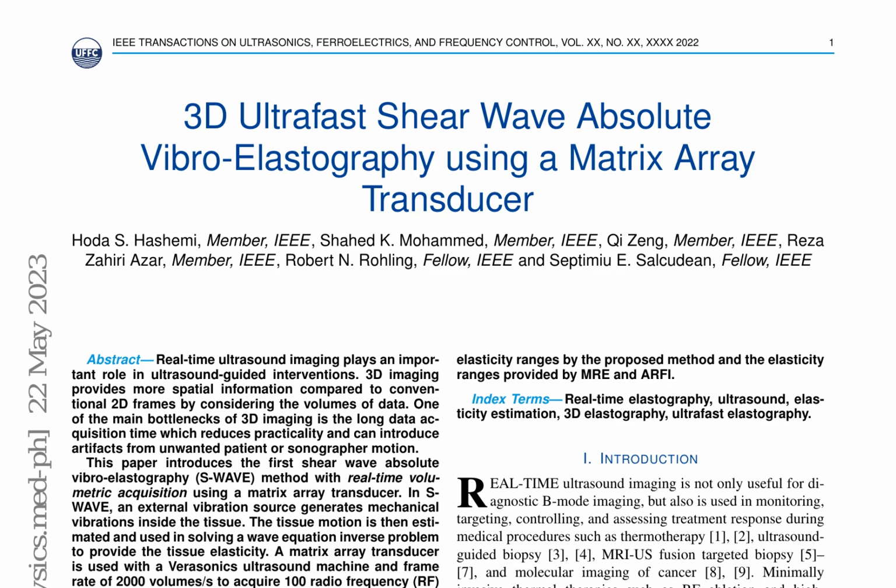This research paper presents a novel method for real-time 3D shear wave absolute vibro-elastography (SWAVE) using a matrix array transducer. The SWAVE technique leverages an external vibration source to generate mechanical vibrations within tissue, which are then estimated and used in solving a wave equation inverse problem to provide tissue elasticity.